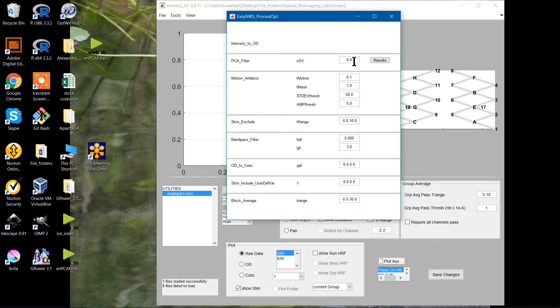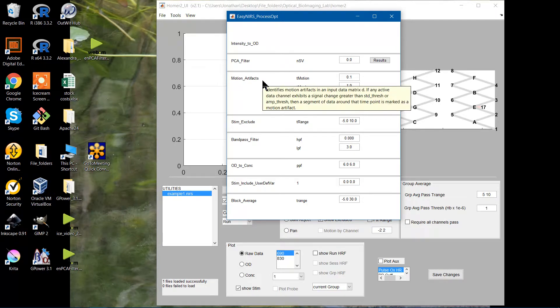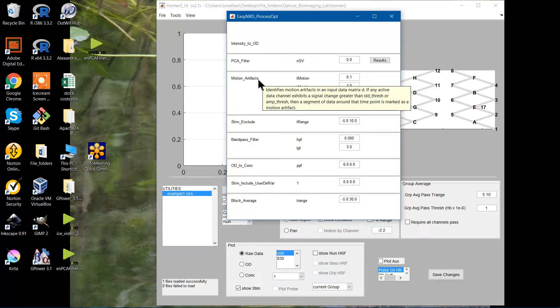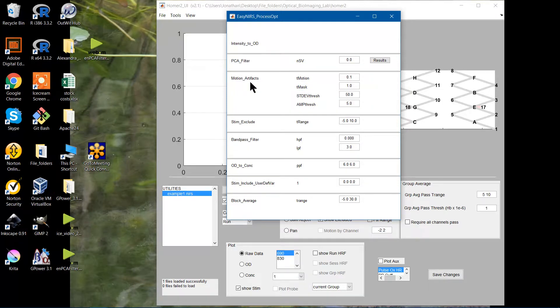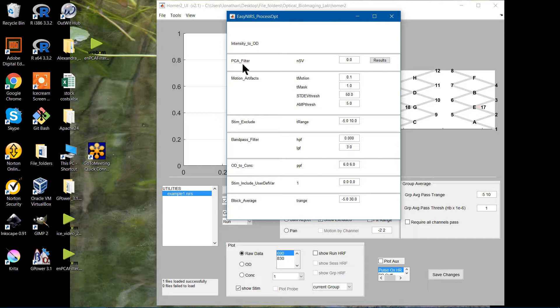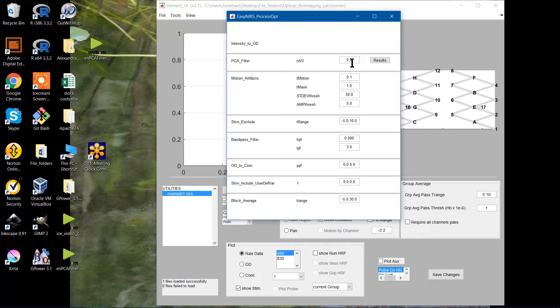All of that is wonderful and highly useful, but you also have the next function, which we'll go over, which is motion artifacts. It will be another video. Arguably, it may get the job done without the PCA filter. Not the same function. They do different things. They are quite similar, and the motion artifacts may satisfy what you're looking to do. Not saying it's not worth doing, but if I were to put one in for my PCA filter, more than likely what that's removing is motion artifacts. So there's quite a bit of overlap there.